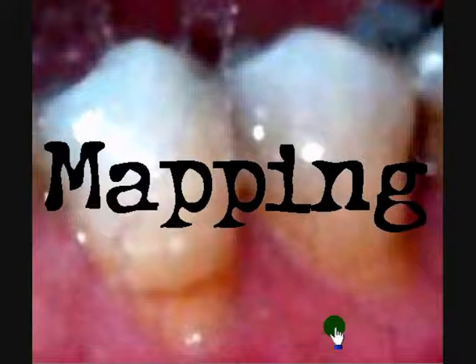So the only information I can get is by mail, by email, and whatever I get with the case. So mapping is a personal technique that I came up with for detecting in which areas of the teeth the color is distributed and with what intensity it appears in those areas.